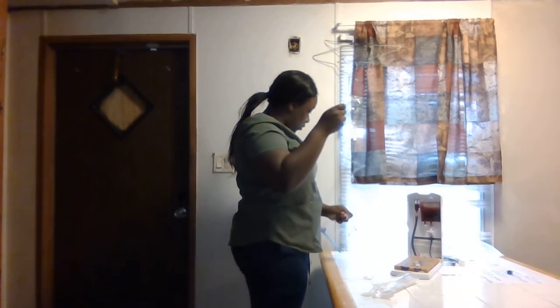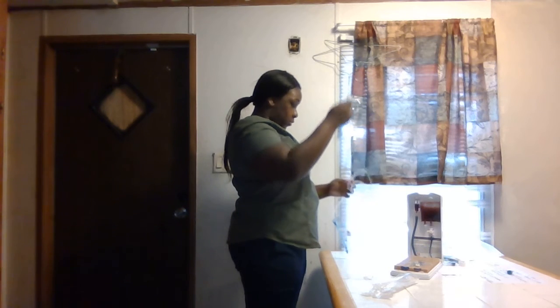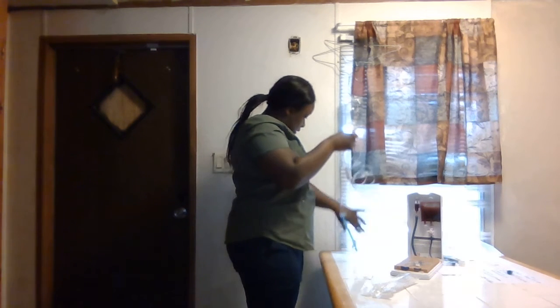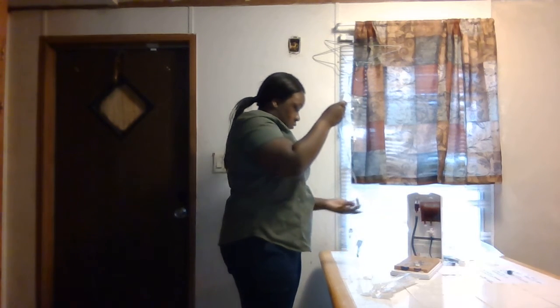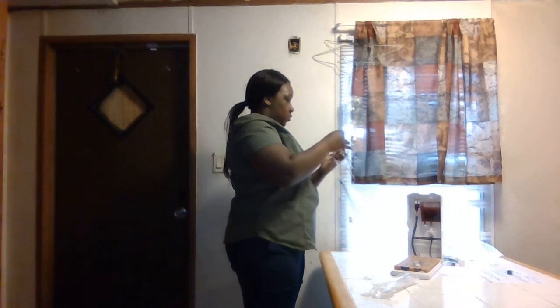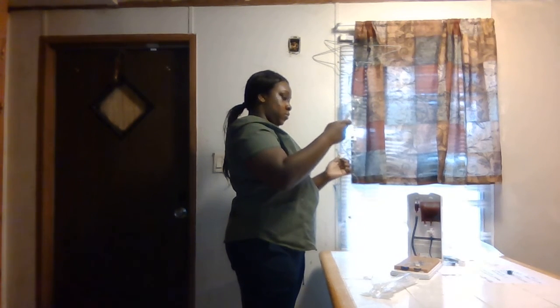And then now we're going to open our clamp. Checking for air bubbles. And again, always invert. Oh, keep my roller clamp closed. I always want to keep control of mine.